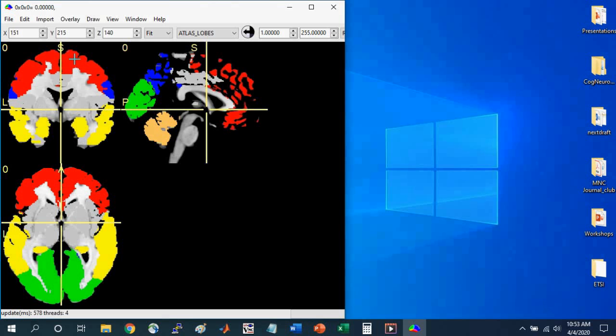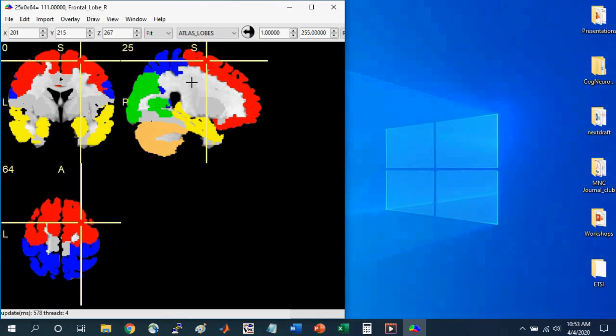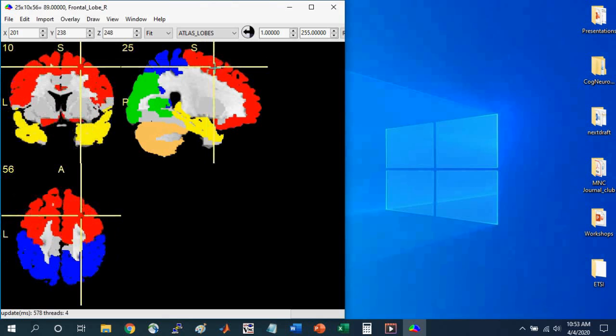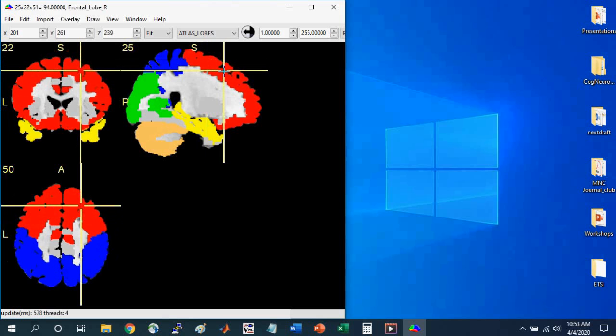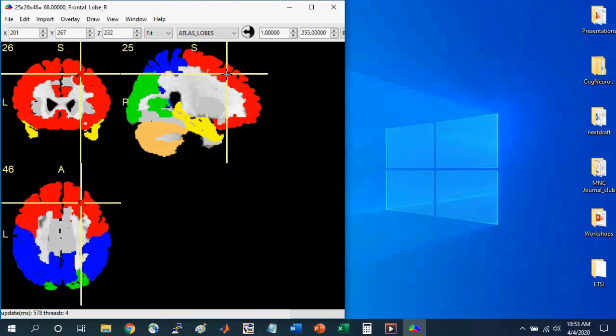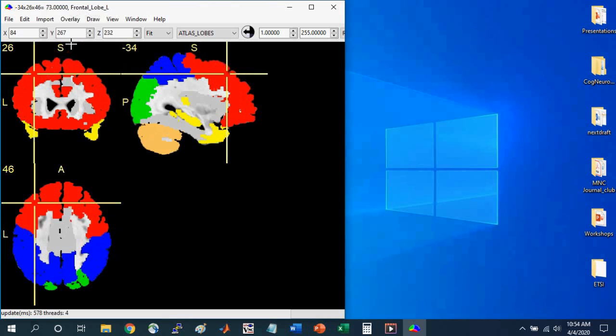So you should see the colors show up in the different lobes of the brain. So if we click on the red area, so left click, here I selected the frontal lobe, specifically the right frontal lobe. And you can look up at the top where it gives the name of the structure. So frontal lobe underscore R. The R means right. If we click on the left, you can see that it changes to L.